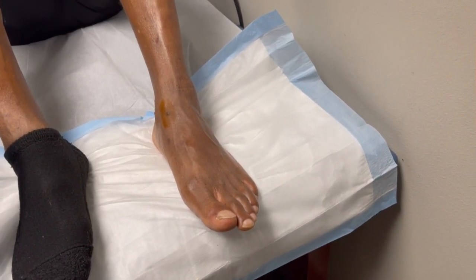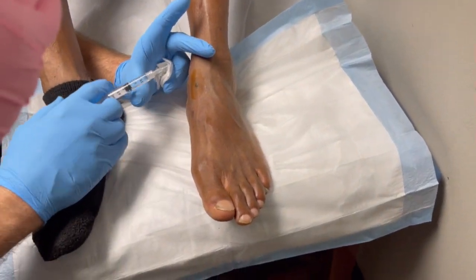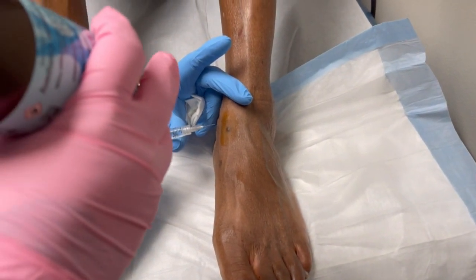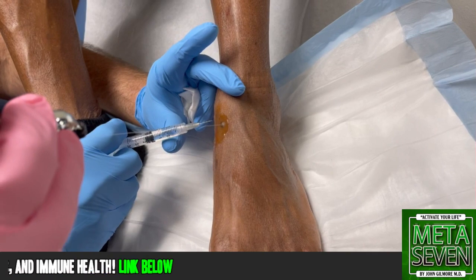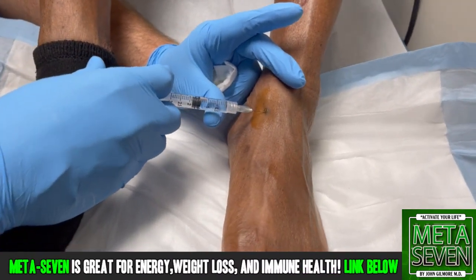You like that, right? I think hot biscuit's good. I've got the world's smallest needle here for you. You're going to go really cold — a little cold spray. You're going to numb. Keep it going, keep it going. That's good. Okay, here we go, a little stick stinging to burn. Ready? Yeah.